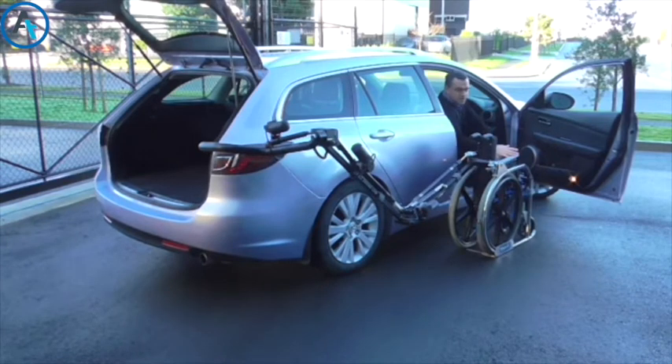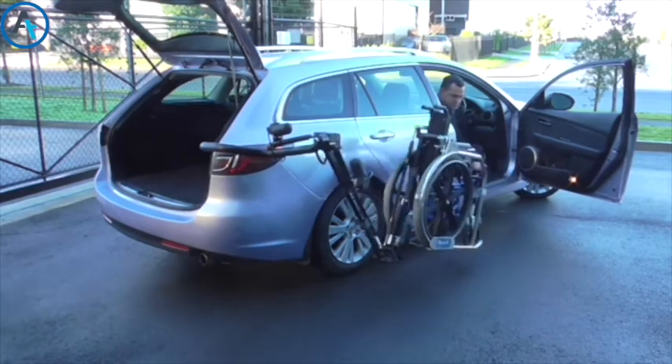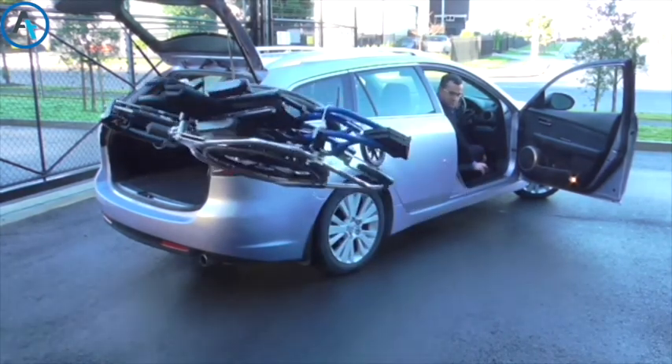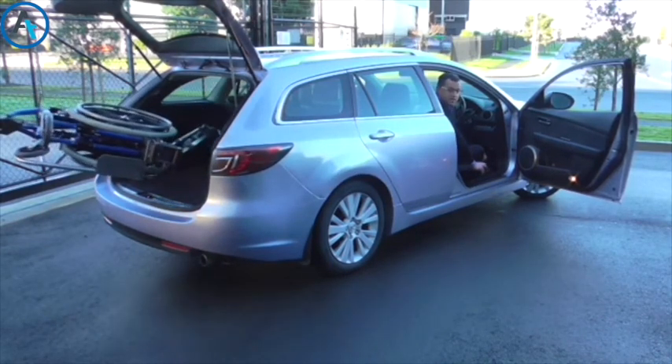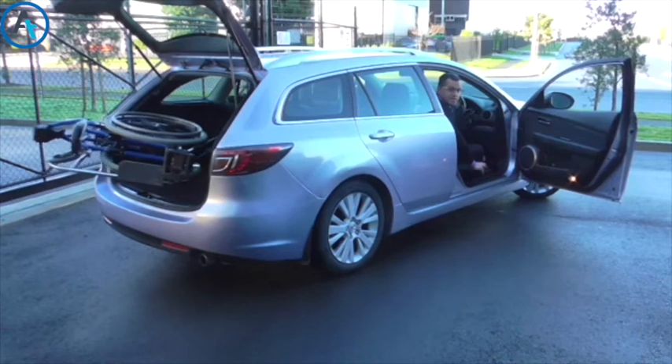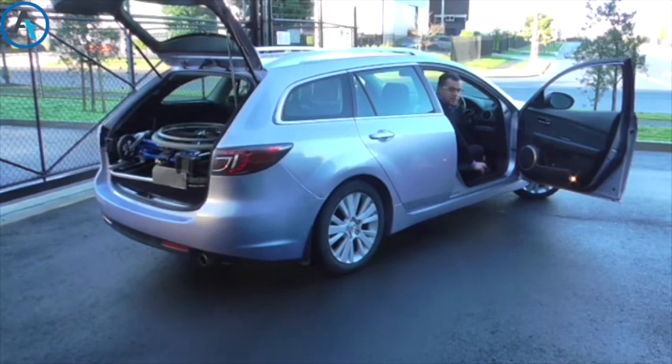I need to transfer over. When I'm done, I need to put it away like so. The wheelchair is tucked away inside the car, nice and neatly. Then the door will shut automatically and I'm ready to drive away.